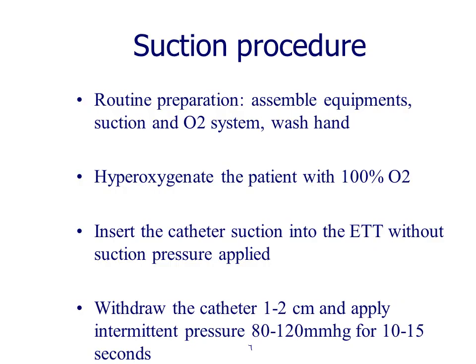Regarding the suction procedure, do routine preparation like assembling equipment, suction, O2 system, and washing hands. Hyperoxygenate the patient with 100% oxygen. Insert the suction catheter into the endotracheal tube without suction pressure applied.